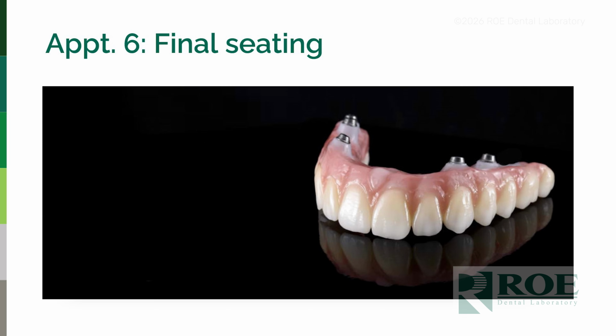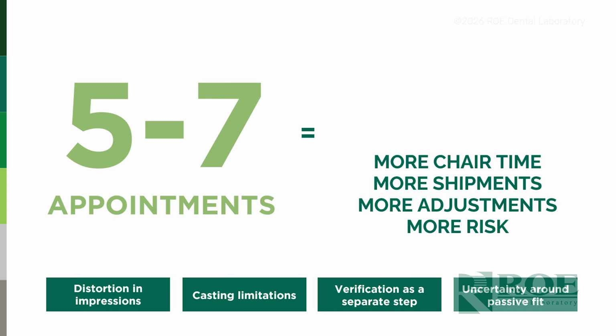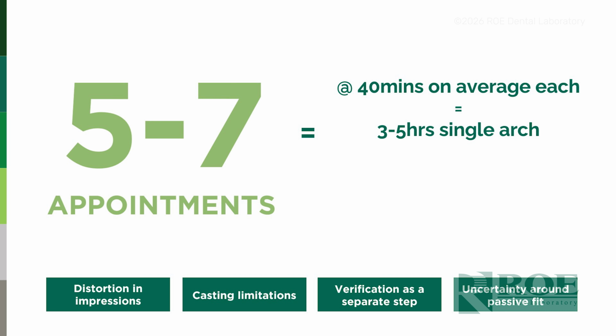If everything was good, back to the lab, final manufacture, out it came, and then there was the fit. And overall, this added up to quite a significant amount of chairside time, the most valuable resource that you have in practice. More shipments, more potentially adjustments. And overall, if you looked at this, for a single arch, this could take anything up to 5 hours.